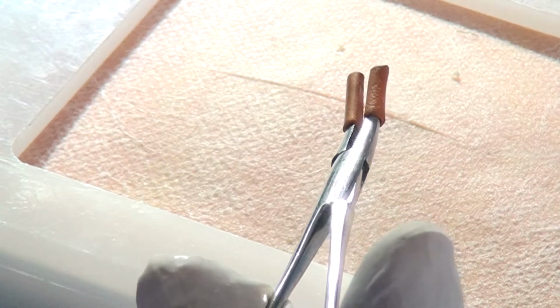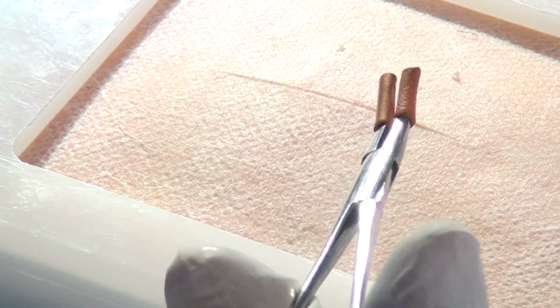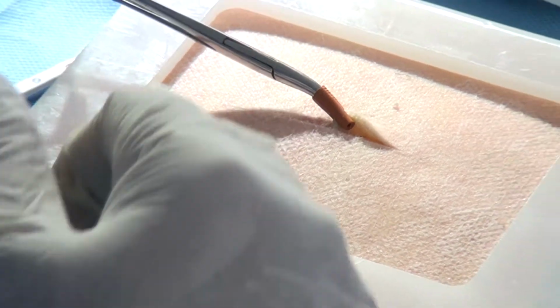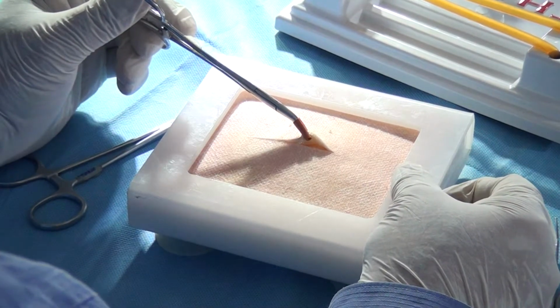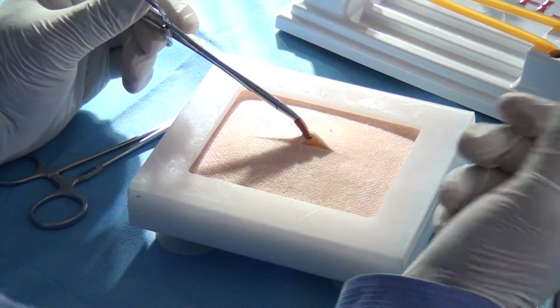And there was a question I asked everybody, why is it called a mosquito? I keep repeating it to all my registrars, they will remember this, all the time I say it. Now this is actually a loaded mosquito, so you can see that it's the same thing, but it's very small. It is holding onto the tissue like this. And the answers given were very interesting, so I'll share with you. One was that it can hold the moustache of a mosquito. It's as precise as that.